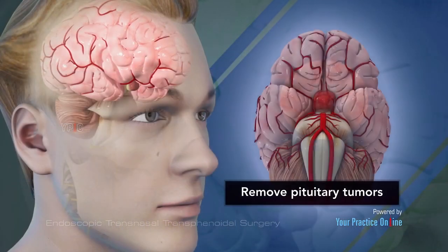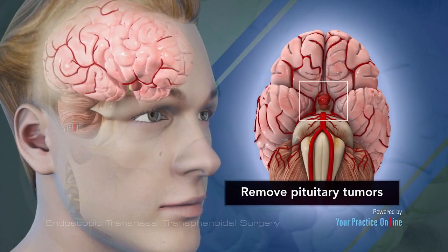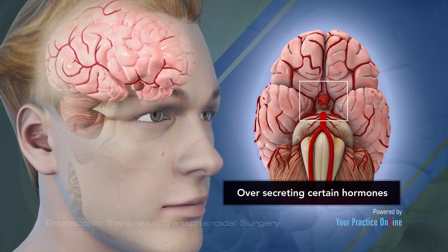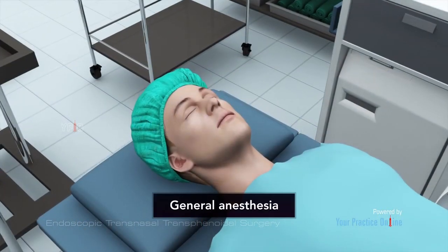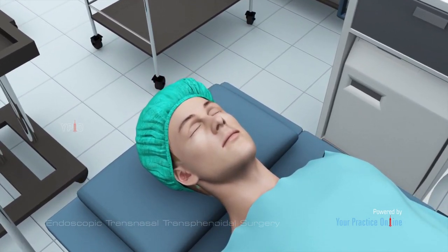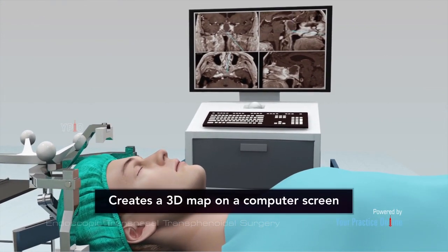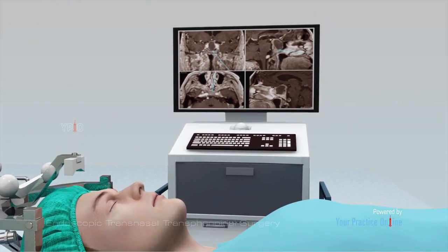Indications: endoscopic transnasal transsphenoidal surgery can be utilized to remove pituitary tumors which are compressing critical brain structures or are over-secreting certain hormones. Surgical procedure: the surgery is performed under general anesthesia. You will lie on your back on the operating table, and your nasal cavity will be prepared with antibiotic and antiseptic solution. An image-guided device is placed on your head which creates a 3D map on a computer screen. This map assists your surgeon in navigating through the nose.